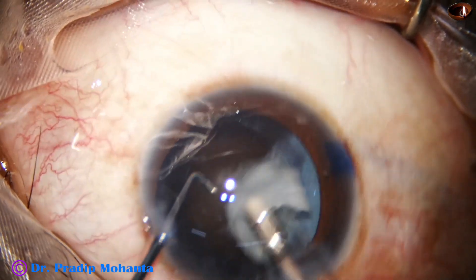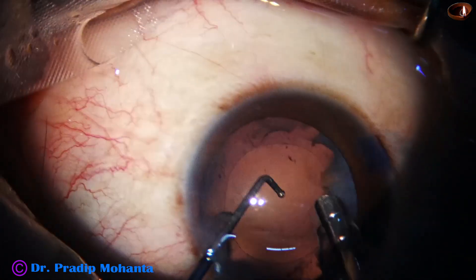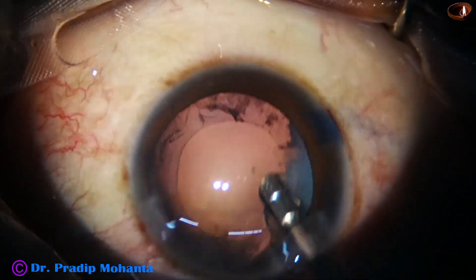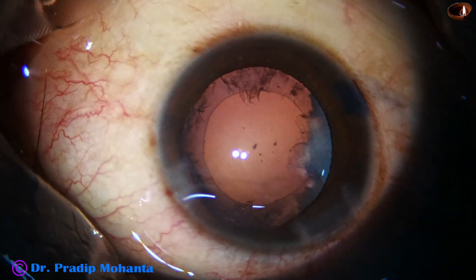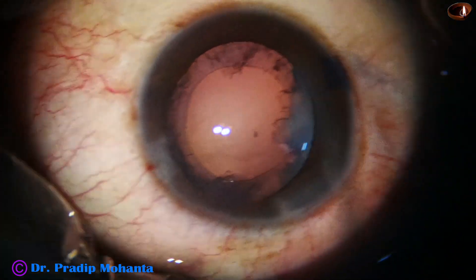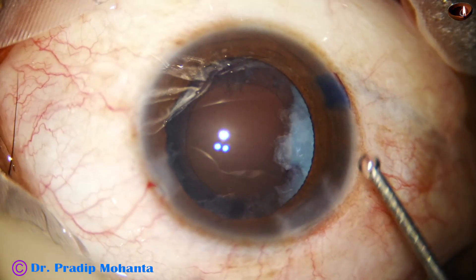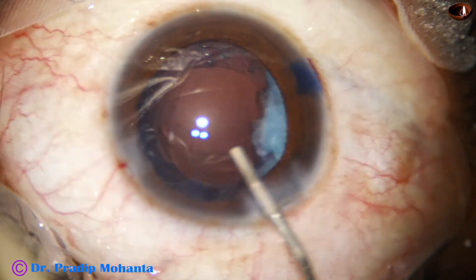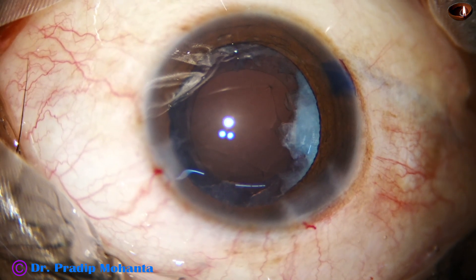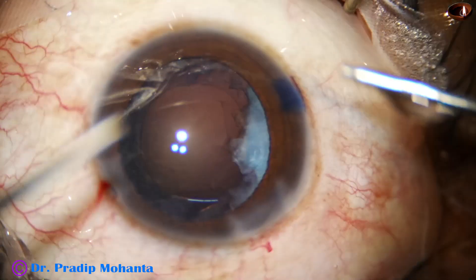Now with the phaco needle, the nuclear material is coming easily — the followability is very good. Vacuum is 480, flow rate is 48, and ultrasonic energy is set at 60, but I am controlling the power by foot switch, so maximum 20% ultrasonic energy is used in such cases.